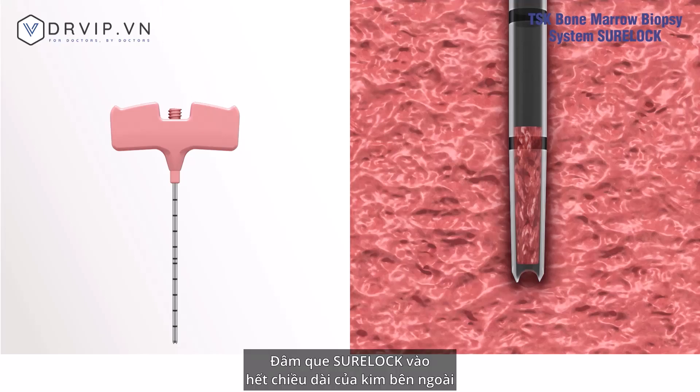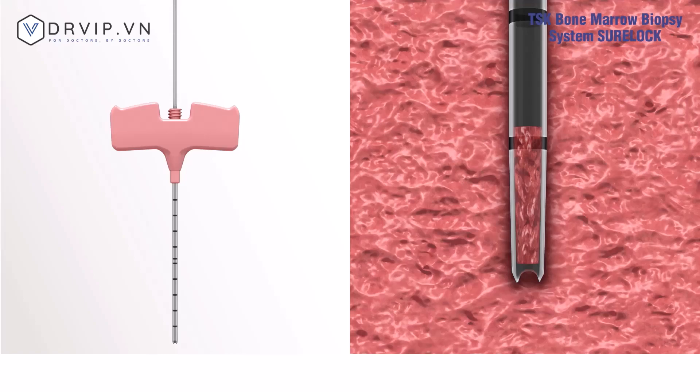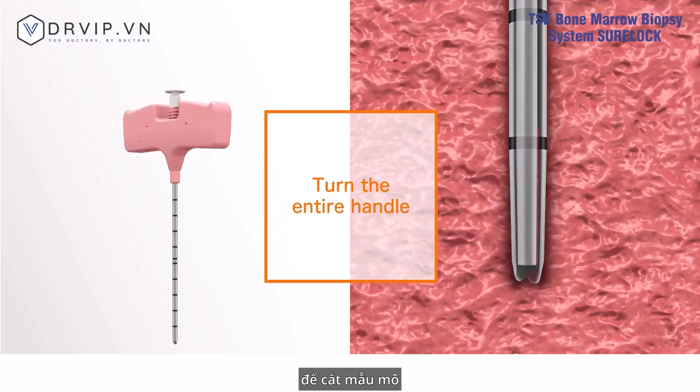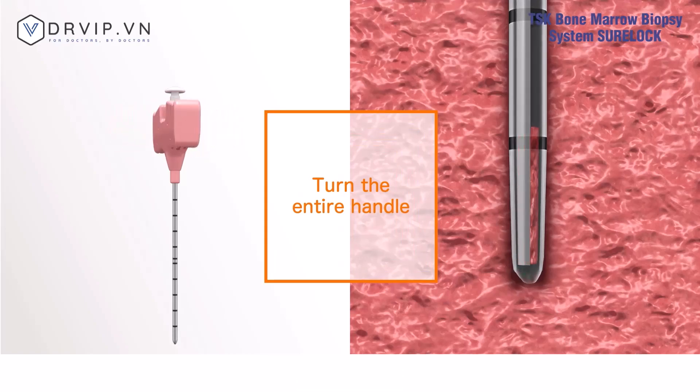Insert the Sherlock completely until it touches the end of the outer needle handle. With the Sherlock inserted, turn the outer needle handle at least 360 degrees to cut the tissue sample. Do not turn only the inserted Sherlock.